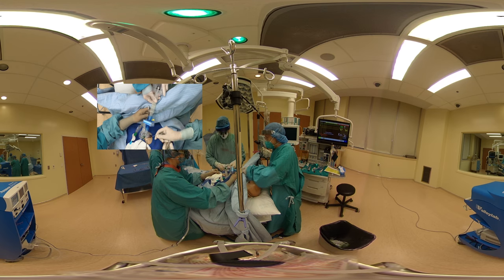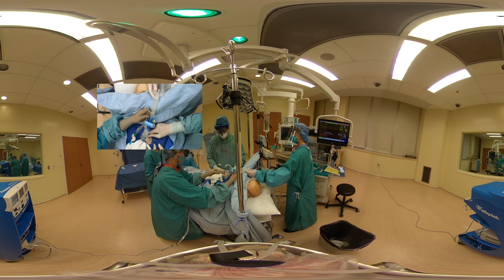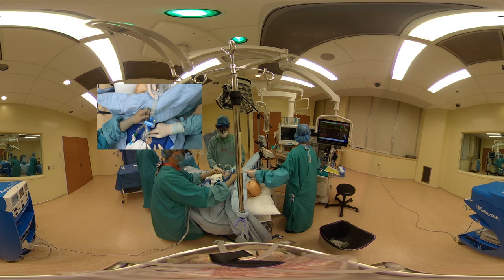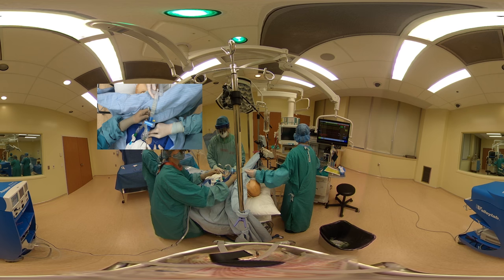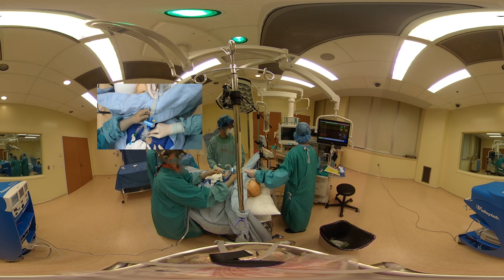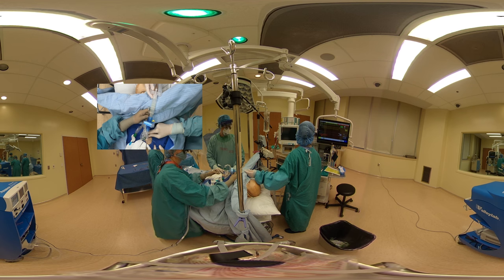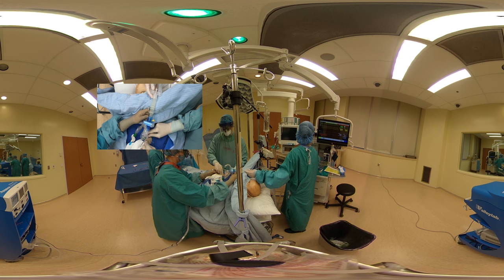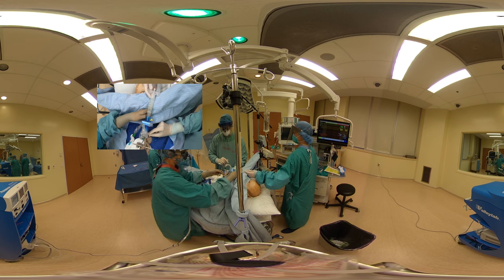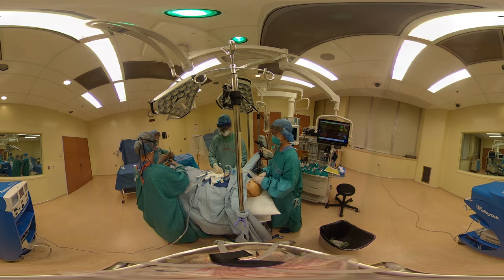Confirming that the cuff is inflated — fully inflated, yes. I'm going to turn on the ventilator now. The ventilator is on. And we have end-tidal CO2. Excellent. We'll now secure the tube with sutures and also with a Velcro trache tie.